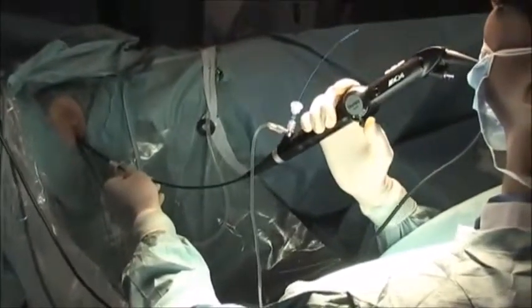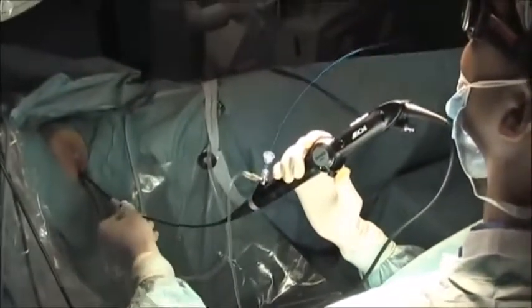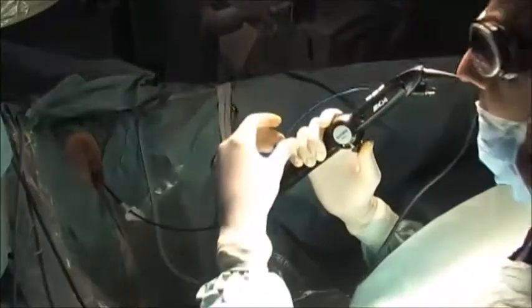In the past few years, progressive improvement in techniques together with recent advancements and downsizing in flexible ureteroscopes has increased the potential of ureteroscopic retrograde treatment of renal stones. As such, this minimally invasive approach to renal calculi is nowadays gaining quite a lot of popularity among the urological community.